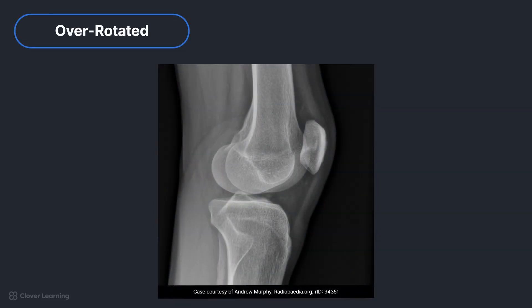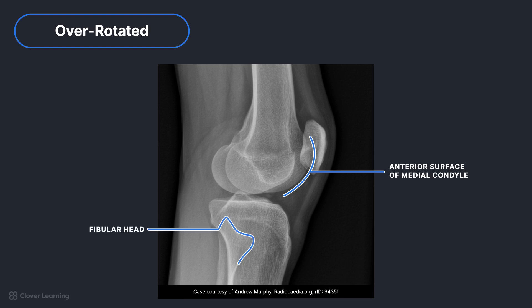In this image, the knee is over-rotated. If we look at the anterior surface of the medial condyle and the fibular head, this time we see the medial condyle is closer to the patella, and the fibular head is almost entirely superimposed by the tibia. This means the knee is too close to the image receptor and must be rotated internally to be in a true lateral.